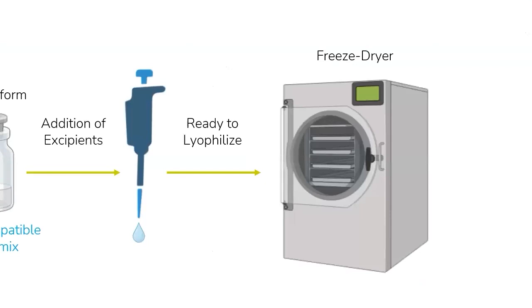For lyophilization, the liquid PCR mixes need to have a lyo-compatible formulation without components that would inhibit the process, for example, glycerol. Also, the lyo-compatible mixes need some additional excipients that would improve the freeze-drying process, for example, components that would stabilize the mixture or help maintain the structure during freeze-drying. So how does freeze-drying work? Freeze-drying works by freezing the material, then reducing the pressure and adding the heat to allow frozen water in the material to change directly to vapor, sublimate.